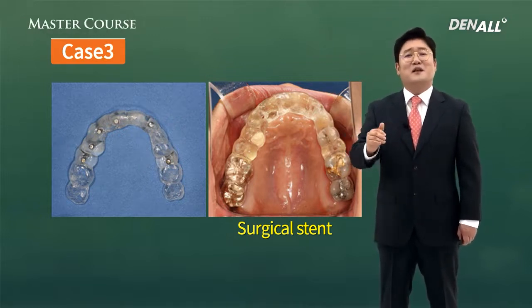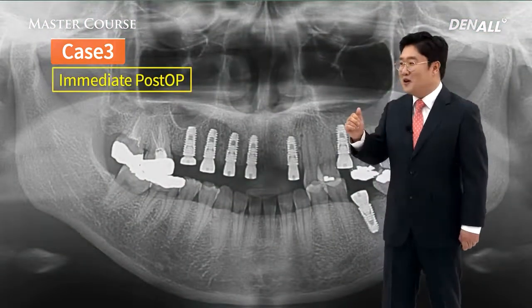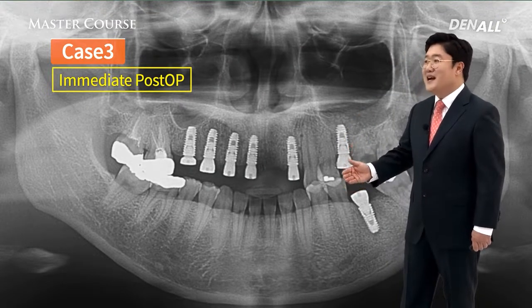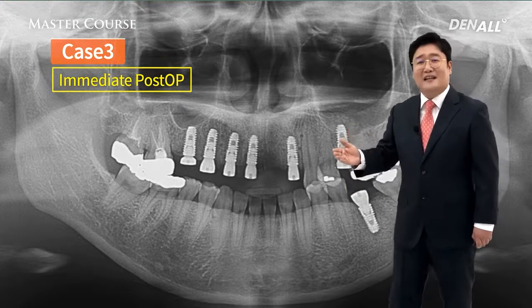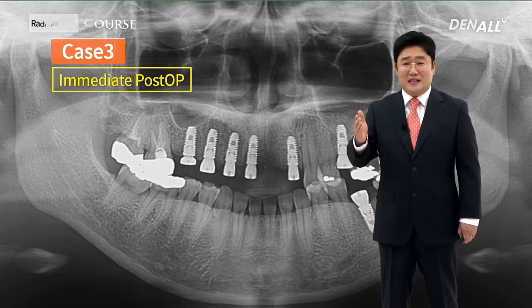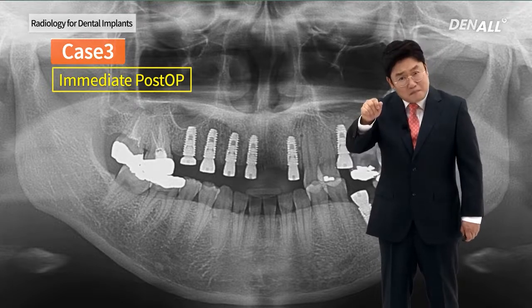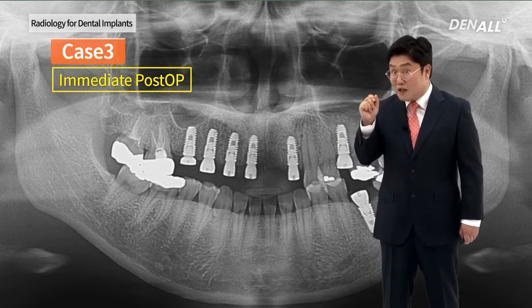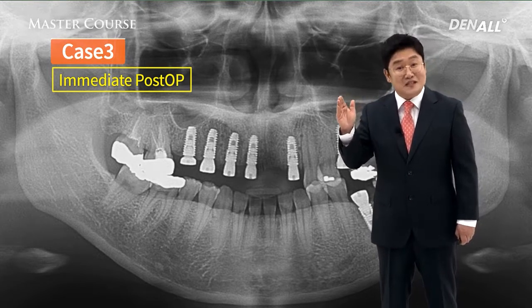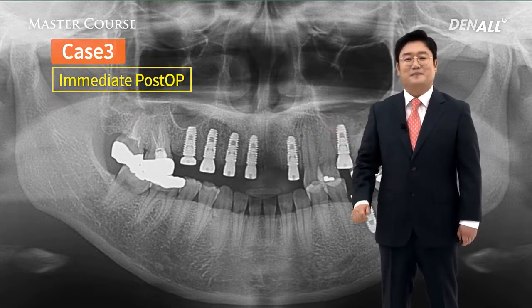In the past, when we did not have digital or CBCT, this was the most advanced technique. After surgery on the panorama, you can see implants were placed very accurately. In the past, panorama radiology, X-ray template, or radiologic template, guide or stent, whatever the name is, after removing the metal rods, surgical template, surgical guide, or surgical stent was used like this. Absolutely necessary to use it. So I wanted to show you this.